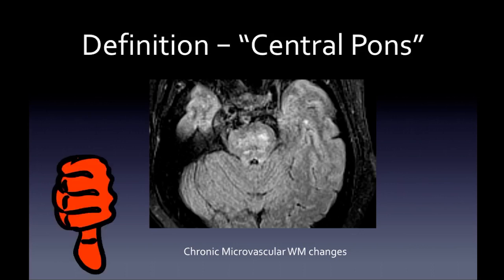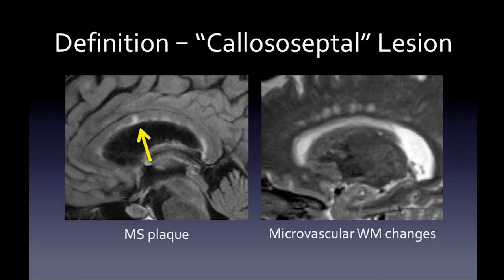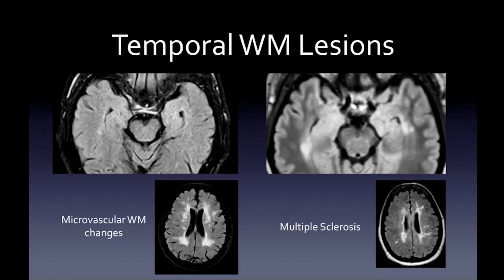The patchy central pons lesion seen with chronic microvascular ischemic changes is not good for MS — you want lesions confined to known white matter tracts. Two additional locations not in the McDonald criteria but more specific for MS: callosal-septal lesions, touching the callosal-septal interface (as opposed to microvascular changes that do not touch), and anterior temporal lobe white matter lesions. Severe microvascular changes tend to spare the anterior temporal lobe, whereas MS does not.